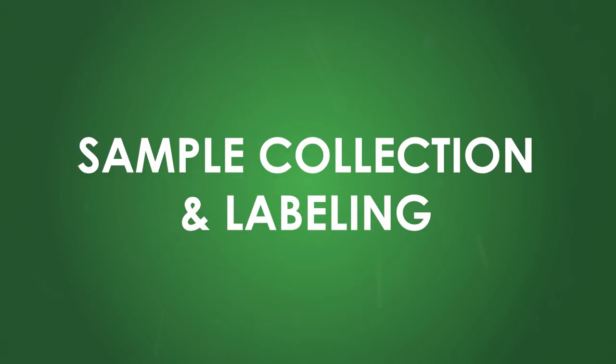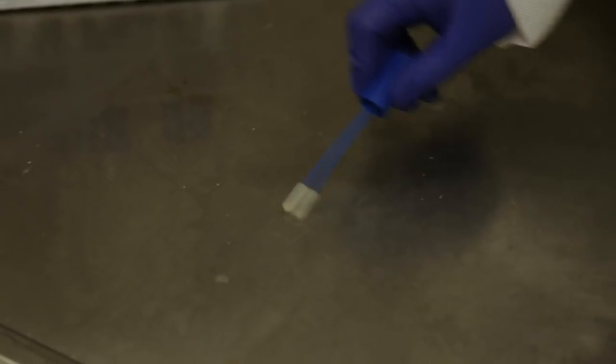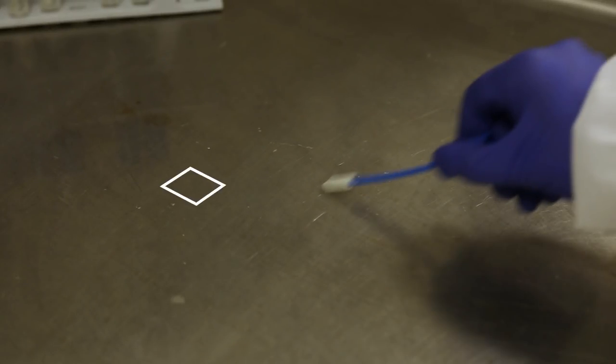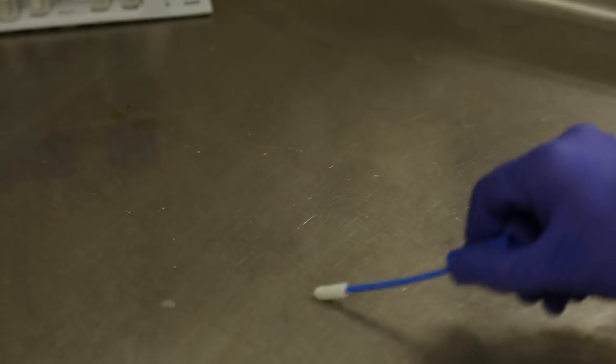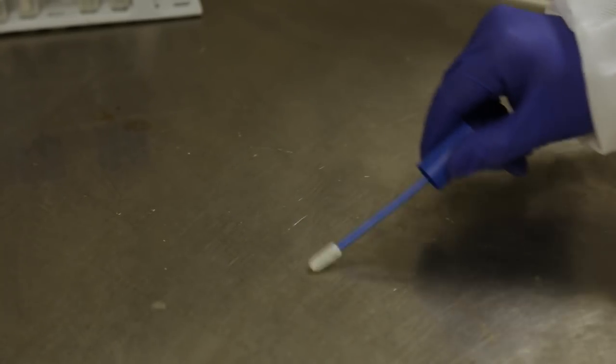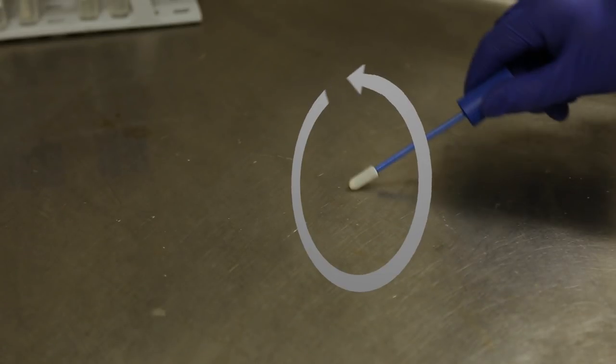Sample collection and labeling. Be sure you are using good environmental sampling techniques as demonstrated. When using a sampling swab, you should be able to cover an area that is between 1 inch by 1 inch and 4 inches by 4 inches. Apply as much pressure as you can, going horizontally and then vertically, then once on a diagonal. While doing this, roll the sampling swab in your fingers.